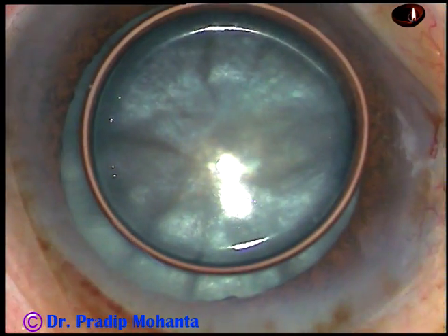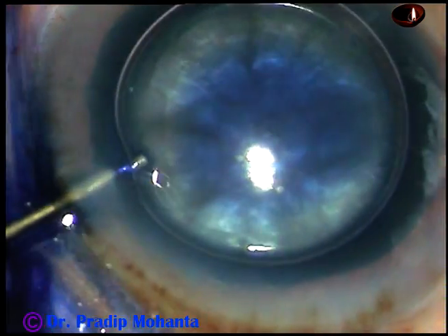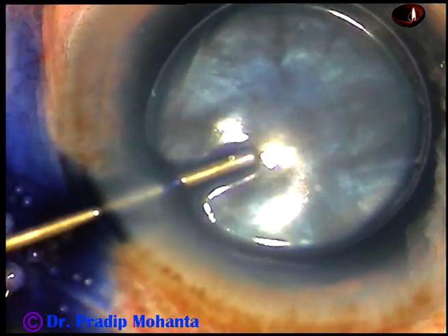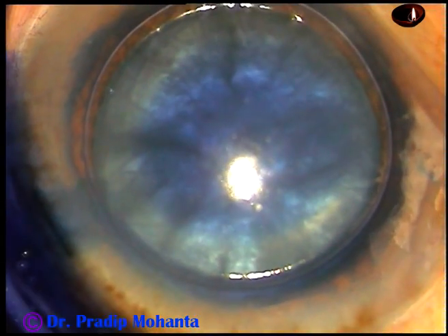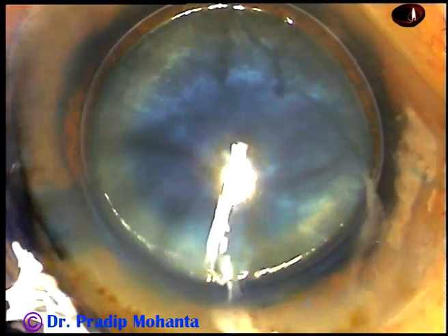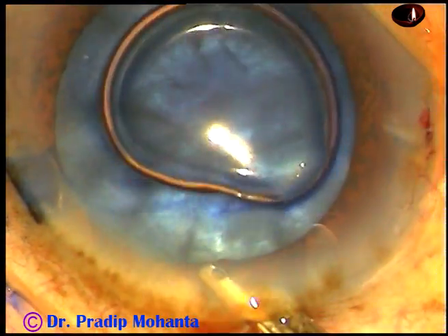And now I want to stain the anterior capsule of this lens underneath this air bubble. And this is Trypan Blue 0.06% dye. The dye is applied on all parts of the anterior capsule. And now the dye is washed out.